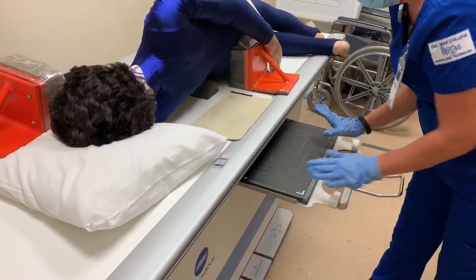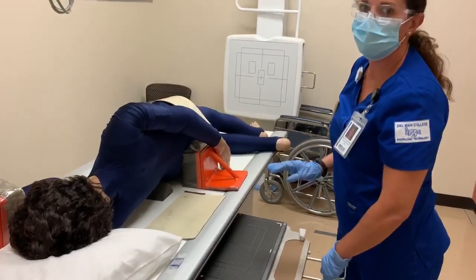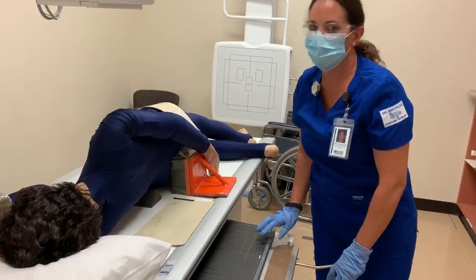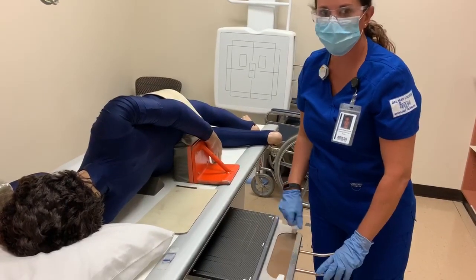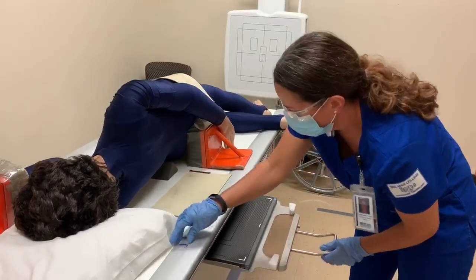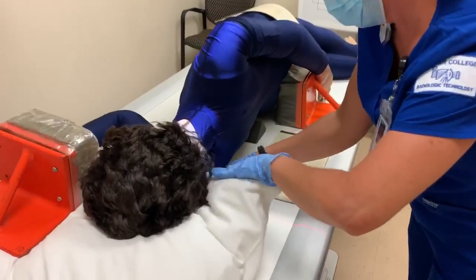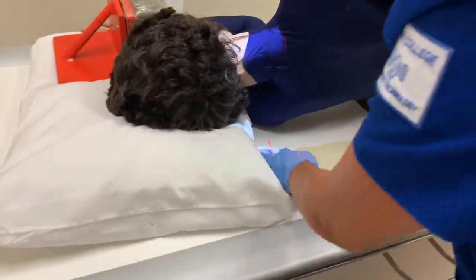If you're using the cassettes, you're going to use a 10 by 12 cassette because it's a smaller area that you're concentrating on. However, all of our digital detectors are the 14 by 17, but just make sure you collimate. And your marker, I like to place mine in the light field so that I know that it's good.